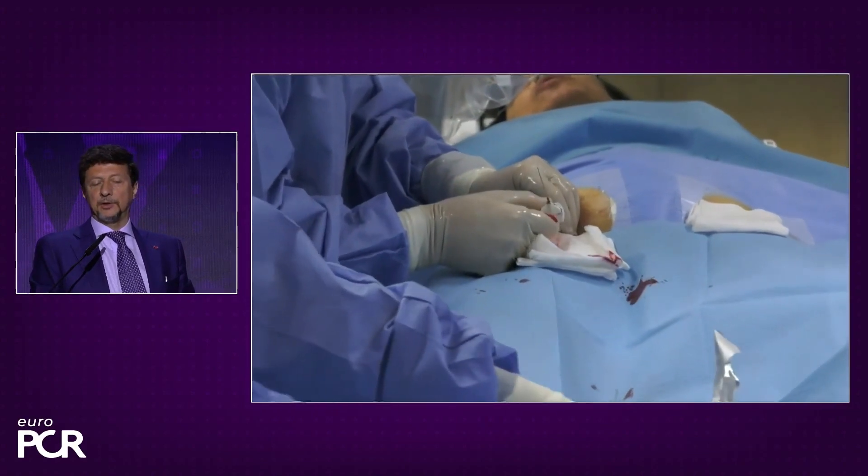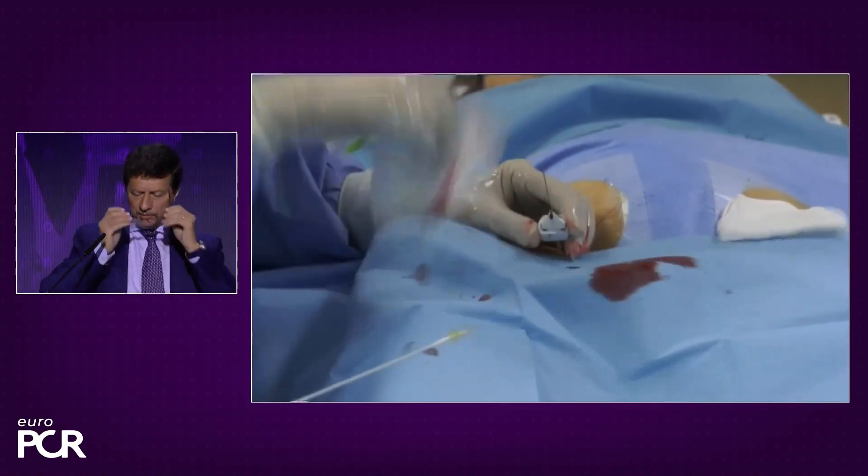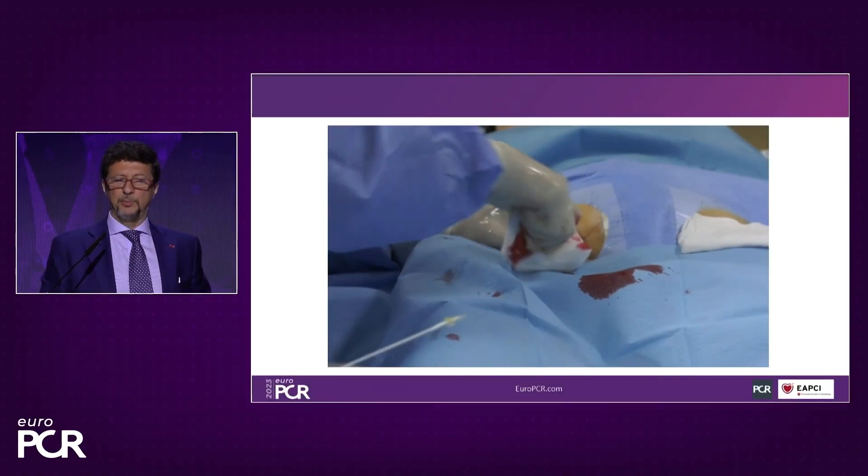Then it is the vessel closure — you can do it by hand, with angioseal, or whatever you prefer. The patient will be able to stand up during the same day and the day after goes home.